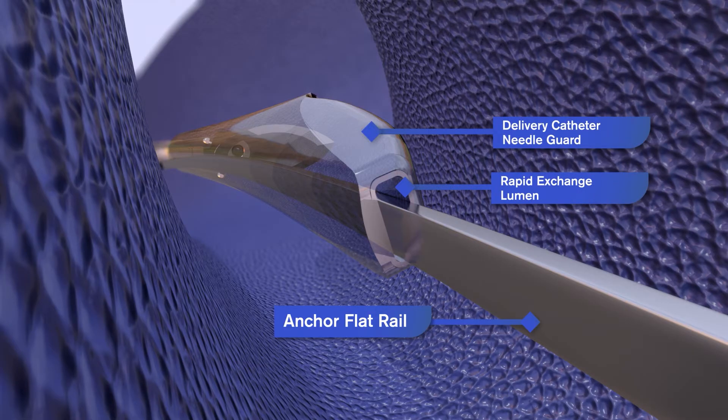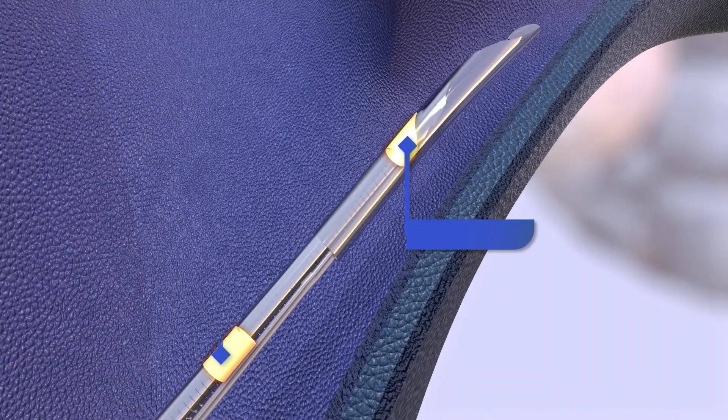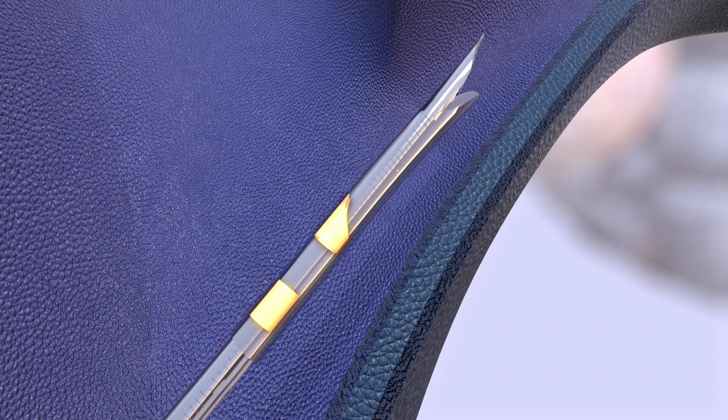Once the delivery catheter reaches the target implantation site within the IPS, needle positioning and orientation is confirmed with imaging. A beveled RO marker is present on the needle guard and is aligned with the needle bevel prior to needle guard retraction. This enables visualization of needle orientation under fluoroscopic guidance. An RO marker is also present on the delivery catheter shaft, proximal to the needle. The needle guard is retracted to expose the needle using a knob on the delivery catheter handle.